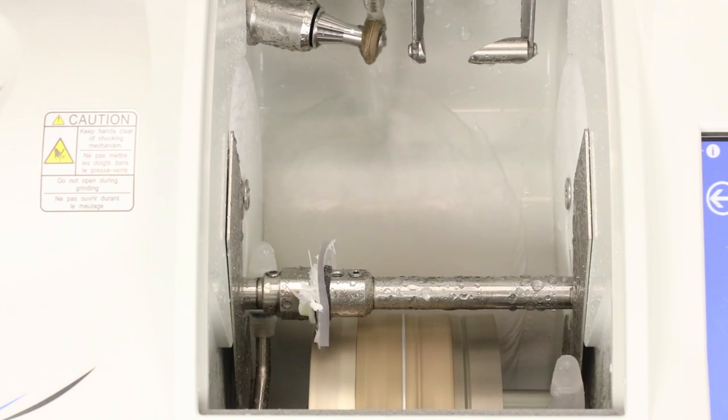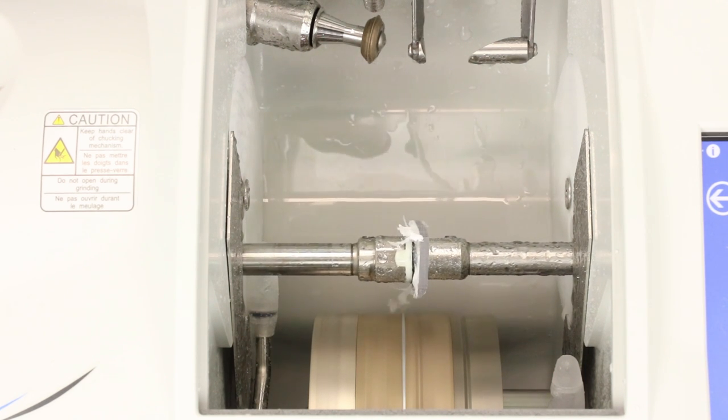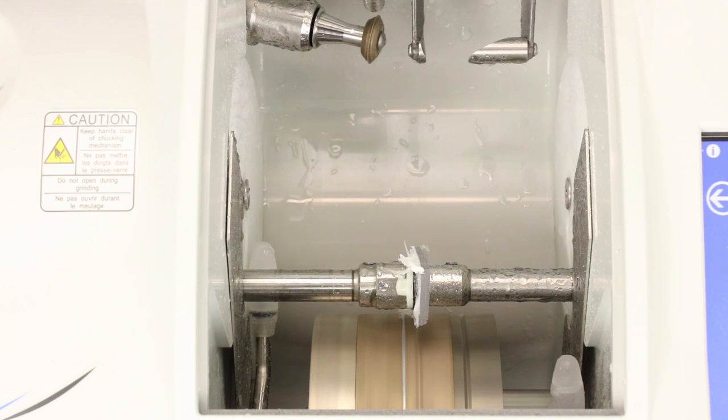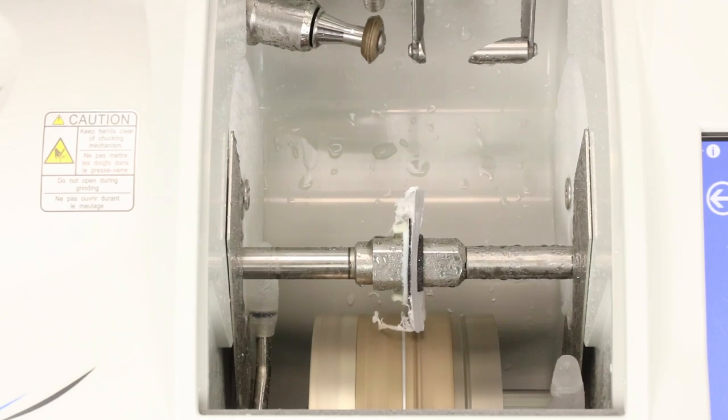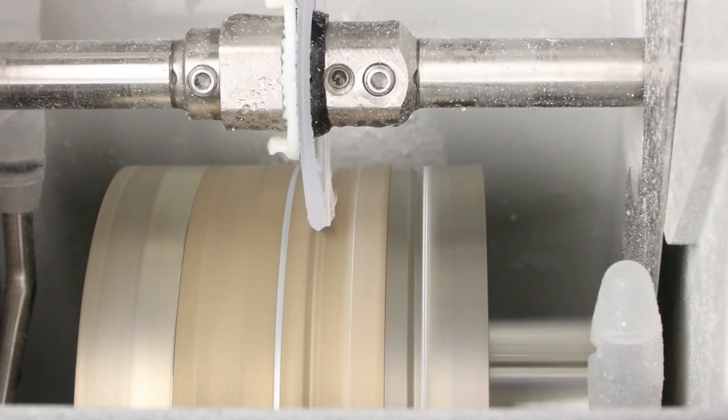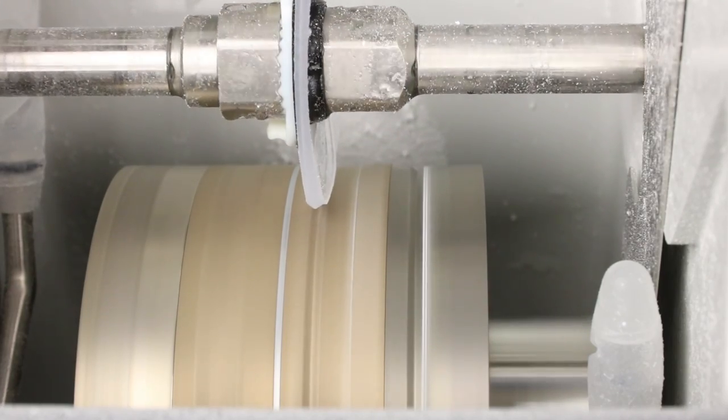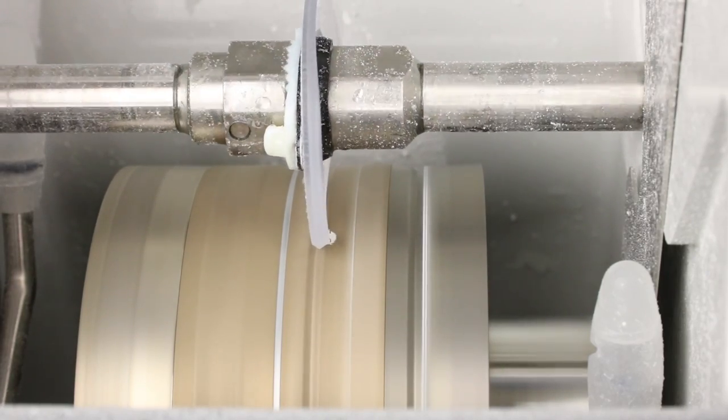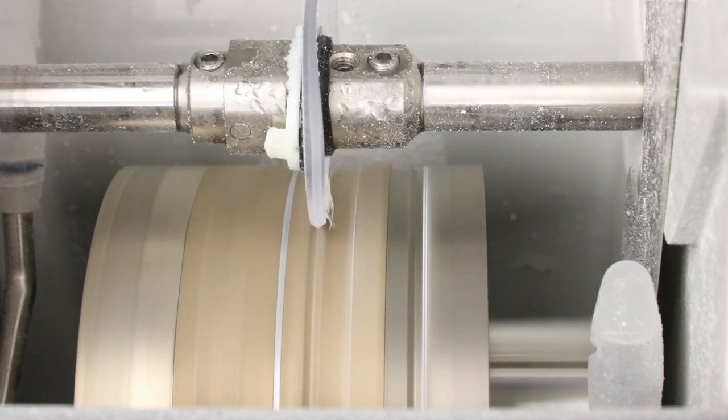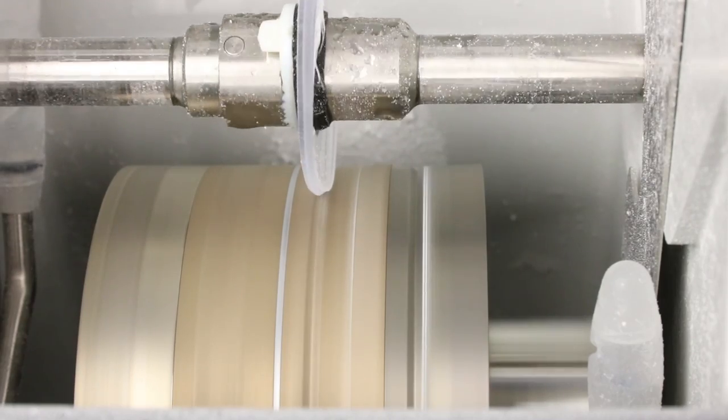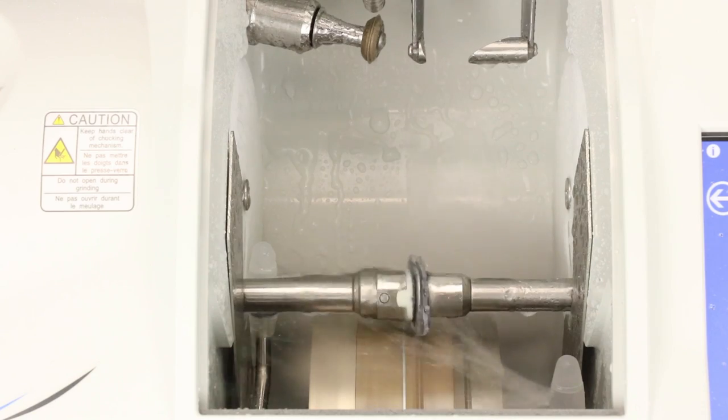Once the lens is roughed into shape, it's going to shift position and move over to the bevel wheel. Here, the edge of the lens is either going to get the familiar notch or bevel shape or a flat edge for future grooving or a flat edge for a drill mount. The silver wheel to the right is for applying a high-luster edge polish. And this lens is just about done.